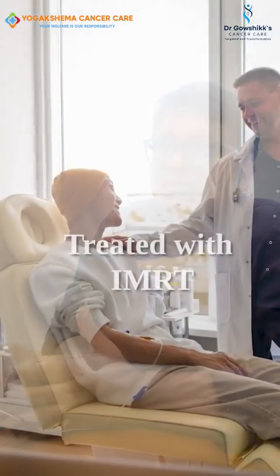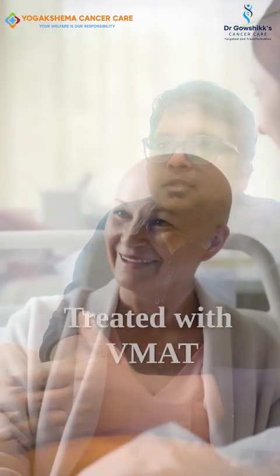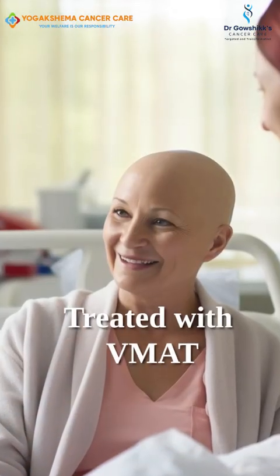Say there is a 38-year-old person who is getting treated for cancer of the throat with IMRT. And at the same time, there is one other lady, some 90-year-old lady, getting treated for the same throat cancer with the VMAT technique. We see the VMAT person, the 90-year-old lady, doing better until the end of the radiation.